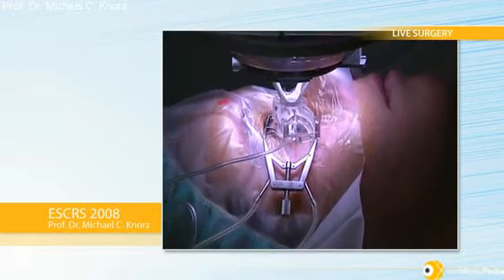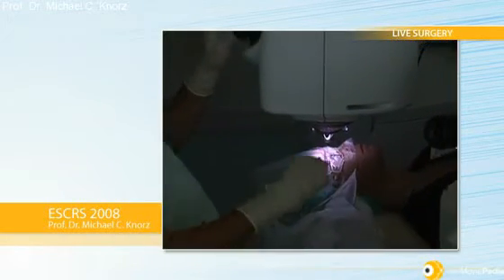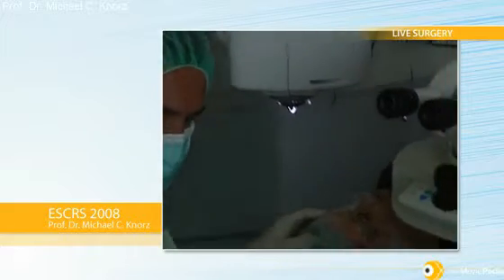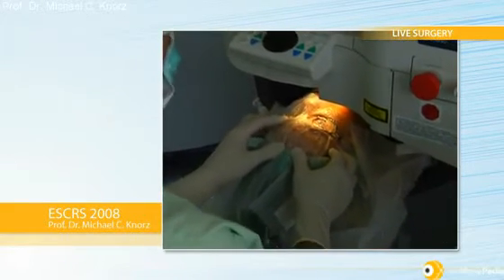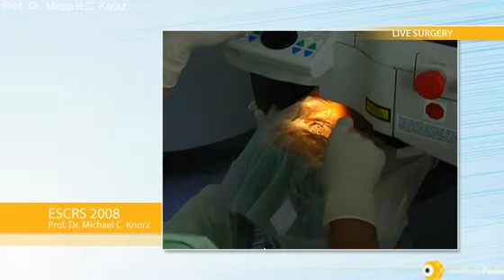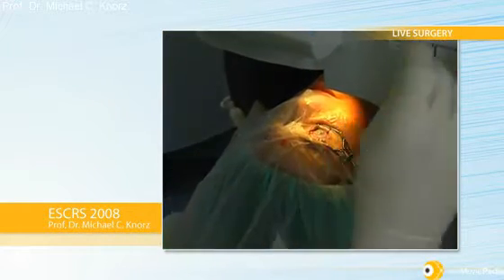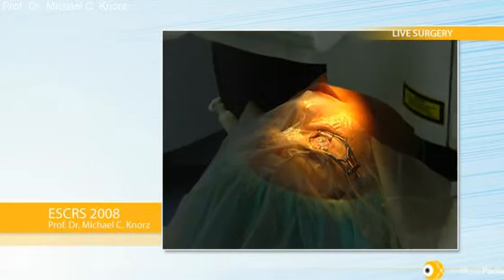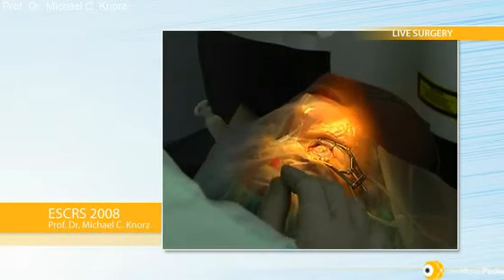Now I release the suction and come up with the laser head. It's just a 15 second flap time. Now we switch over again to the Visex laser. I do custom wavefront in 100% of cases — basically 99.5% because there is the occasional case where you cannot get a wavefront capture.